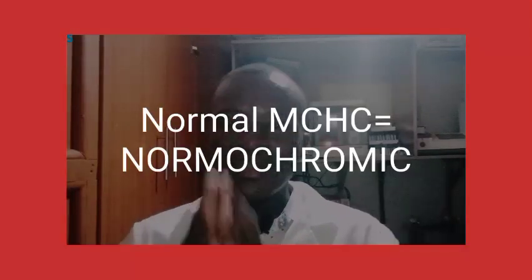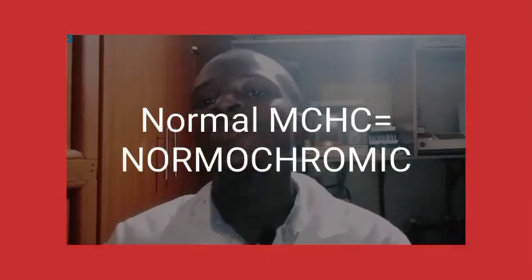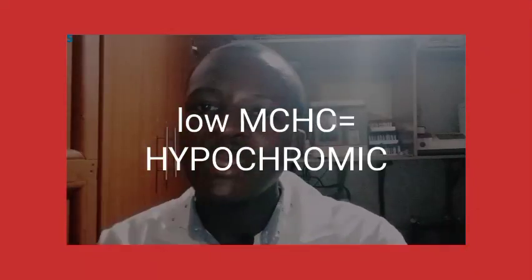So when the MCHC is normal, we refer to that condition as normochromic. When the MCHC is low, we refer to that condition as hypochromic. So you can actually have a type of anemia called hypochromic anemia. What does this mean? It means it is an anemia that is associated with low MCHC.